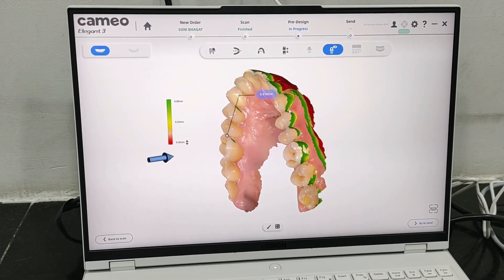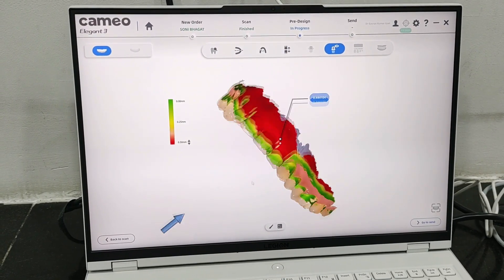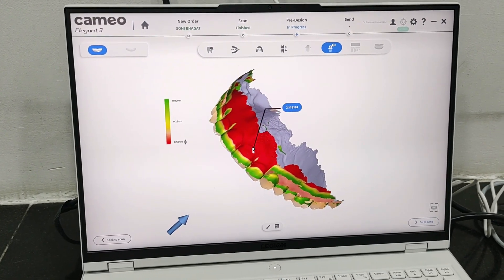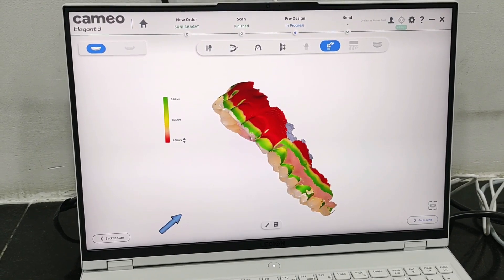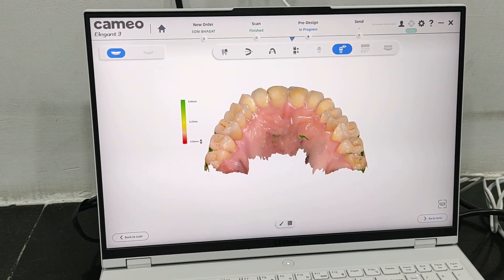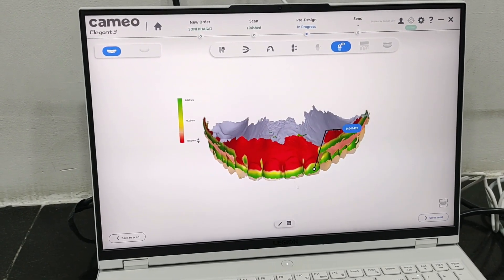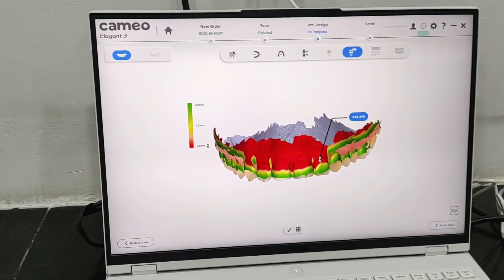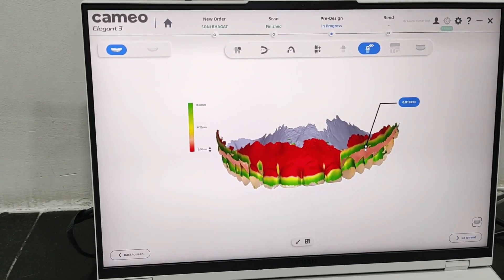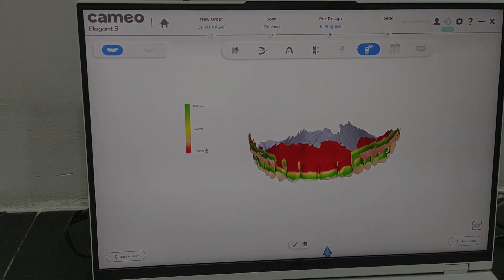Basically, once you have it, there are a lot of things that can be done. It all depends on how deep you want to go into digital dentistry. This is the first thing that you need to go into digital dentistry. Once you have the data, you can go into exocad software or other trial software — you have to buy those separately for designing, or your lab can do it.